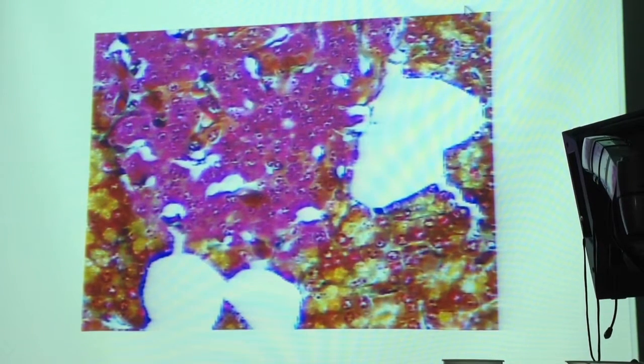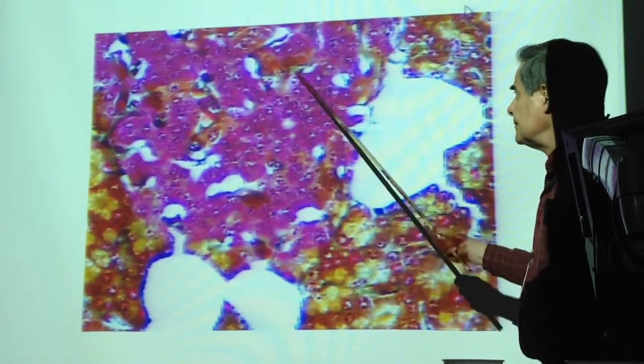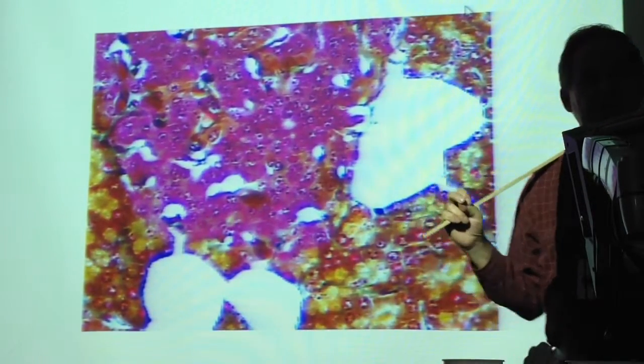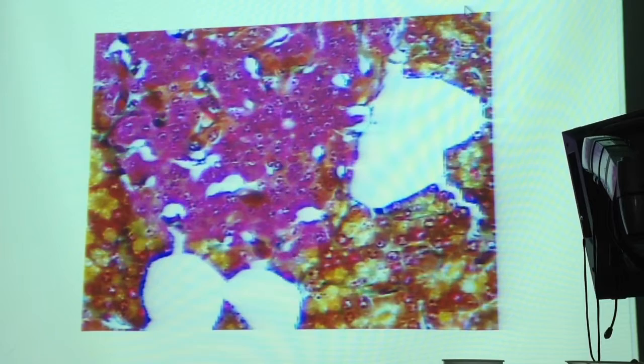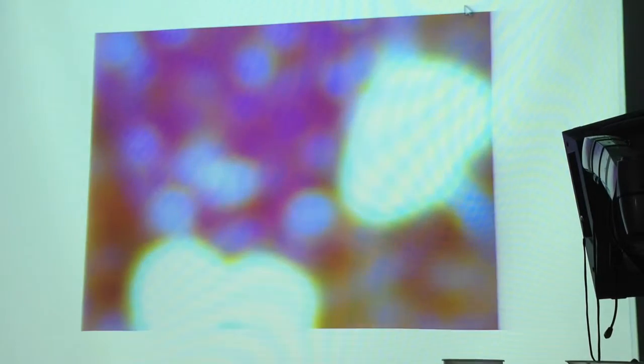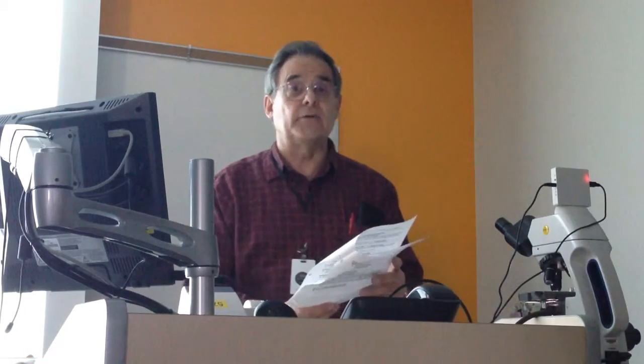And actually, we got two other cell types in there too. One of which I'll expect you to pick up. They're not as common as the other two. They have kind of a tan cytoplasm. Now these cells are called delta cells. Delta cells produce what is called somatostatin. We mentioned this before, those are also produced by the enteroendocrine cells at the base of the gastric glands. But if you look at the bottom of page 2 in your hormone handout, again, the pancreatic hormones, glucagon, insulin, and then somatostatin from the delta cells.